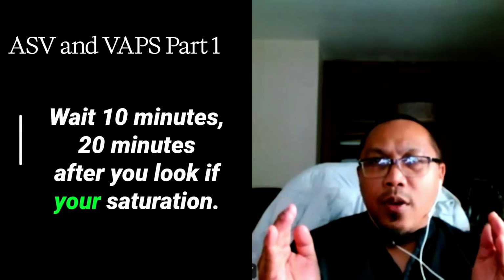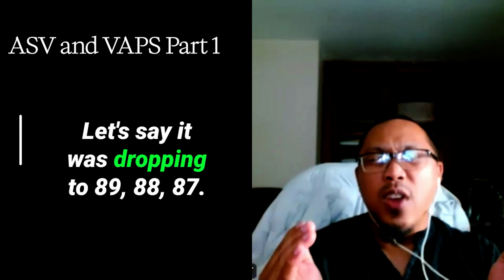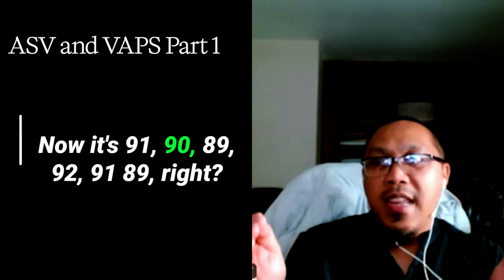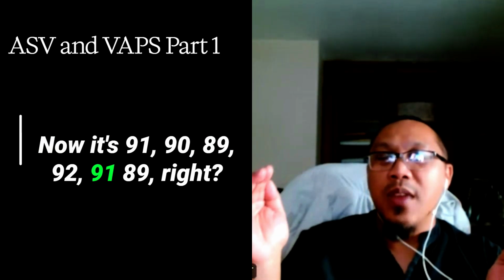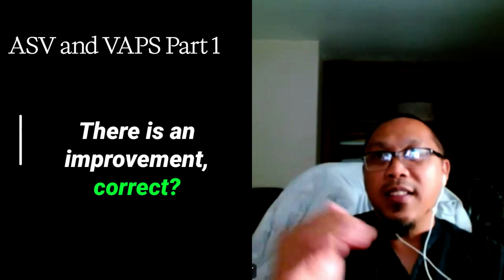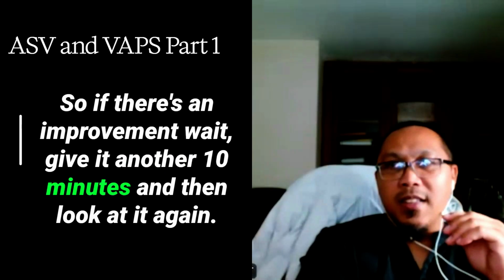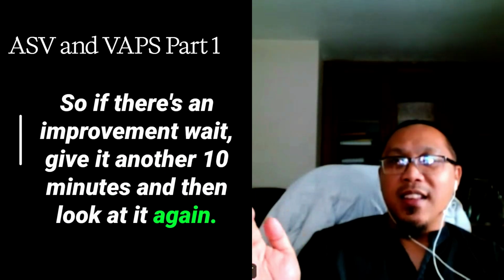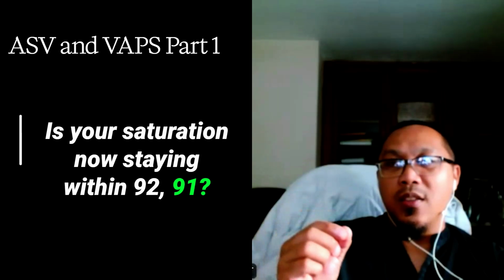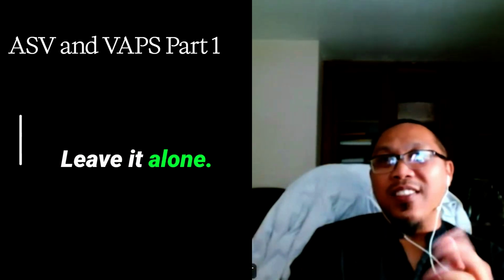If your saturation is slowly improving, let's say it was dropping to 89, 88, 87, and now it's 91, 90, 89, 92, 91, 89, there is an improvement, correct? So if there's an improvement, wait, give it another 10 minutes and then look at it again. Is your saturation now staying within 92, 91, no more drop under 89? Then you are fine. Leave it alone.